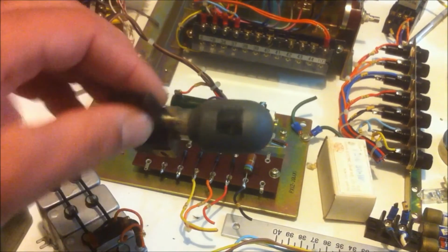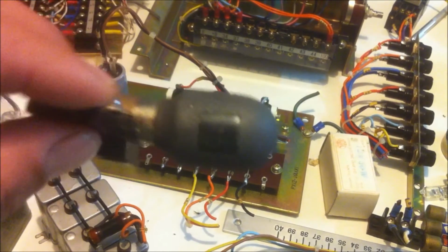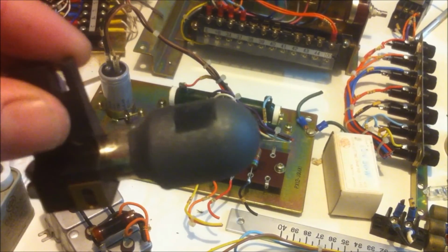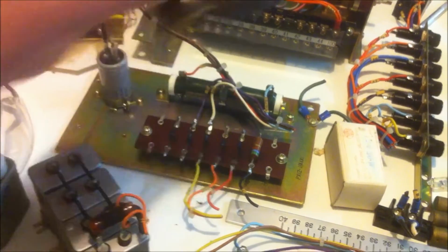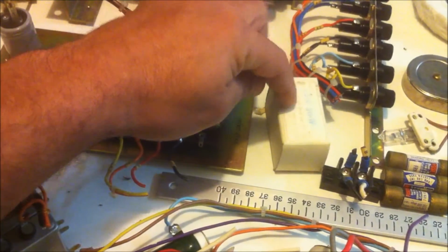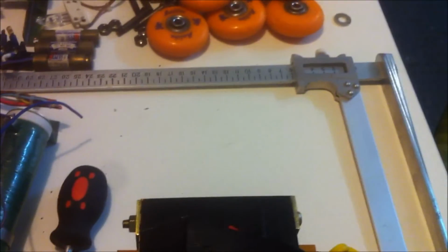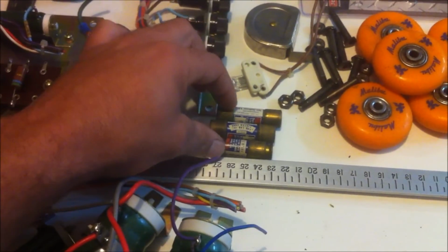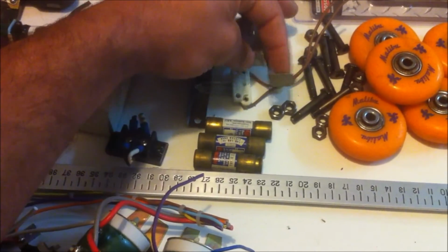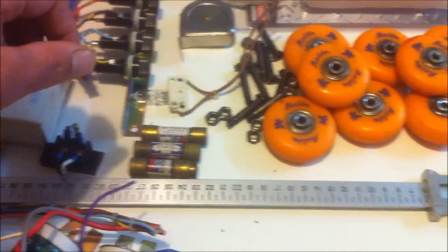These light bulbs were in the shutter assembly, but they seem to be coated with some sort of a graphite-y looking powdered substance. I don't really want to touch it, but if anyone knows what that is, I would love to know. I've got two of those. I've got one spare one that came in the box there. And I also managed to get a little bone measuring thing here that was in the storage compartment. Got a few fuses, a little tape measure that was attached to the actual X-ray head itself.